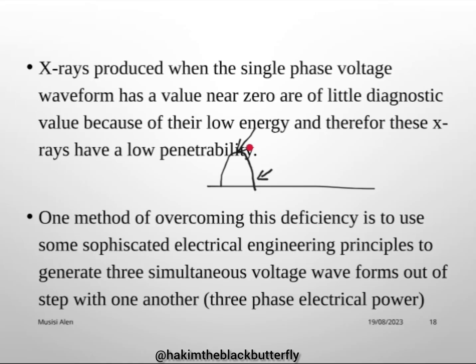Single phase power carries only one voltage. Three-phase power carries three voltages which are out of phase with each other.